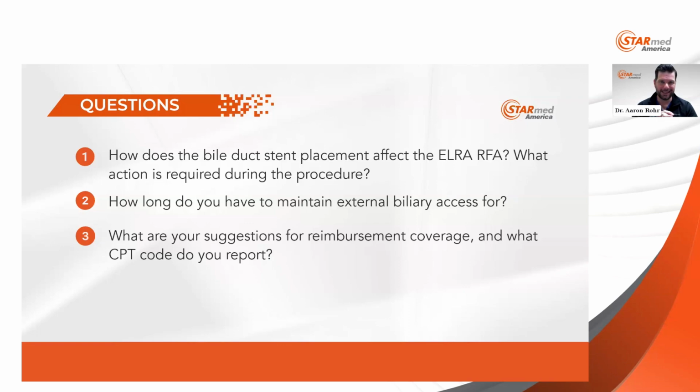I will say that in the setting of indwelling biliary stents, the removable ones, exchangeable ones via GI, as I described, I do move them out of the way to ablate. I don't feel comfortable ablating those. So I'll just snare those and take them out myself, ablate, and then either put our drain in or that stent back. I have never ablated one with an adjacent stent in it, just out of worry that temperature or anything along those lines will cause an issue.